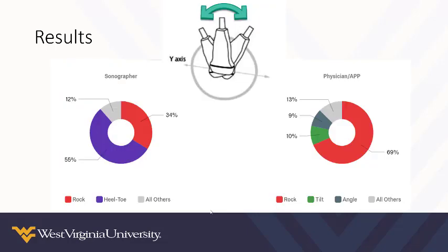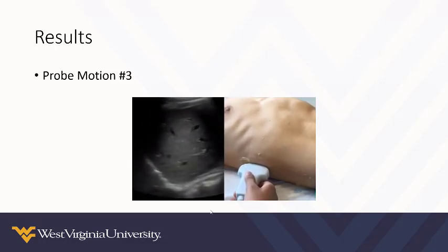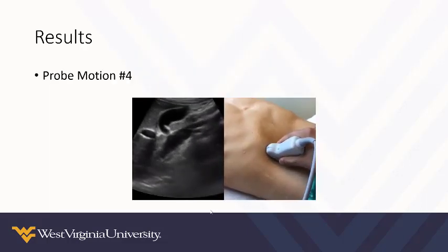The majority of sonographers referred to this movement as heel toeing, while physicians referred to this movement as rocking. Here we have probe motion 3. Both the majority of physicians and sonographers agreed that this probe movement could be called a slide. Here we have the 4th probe movement.